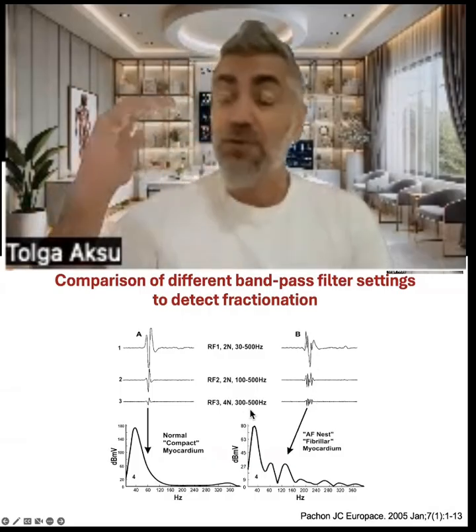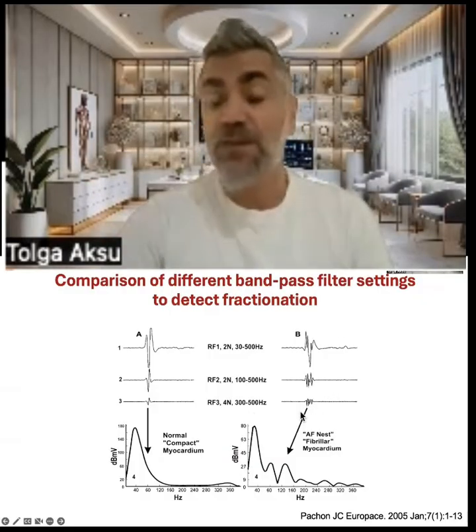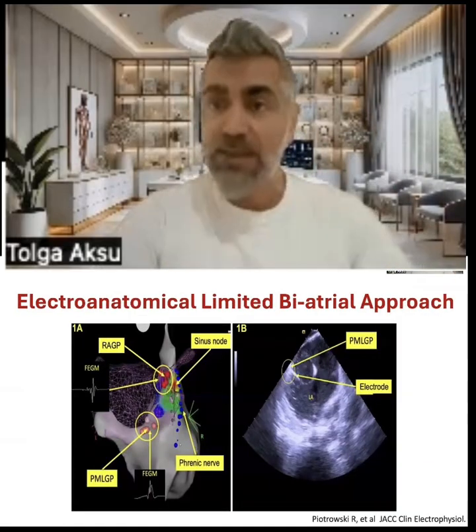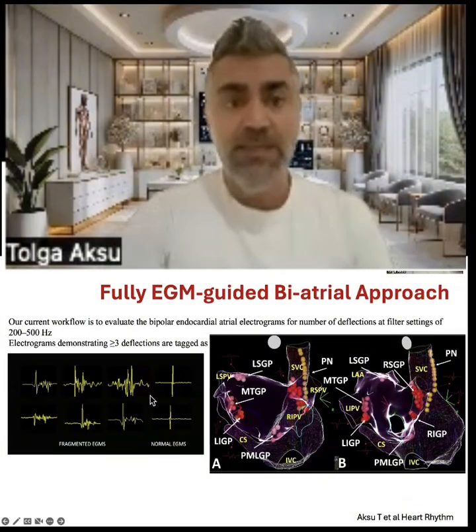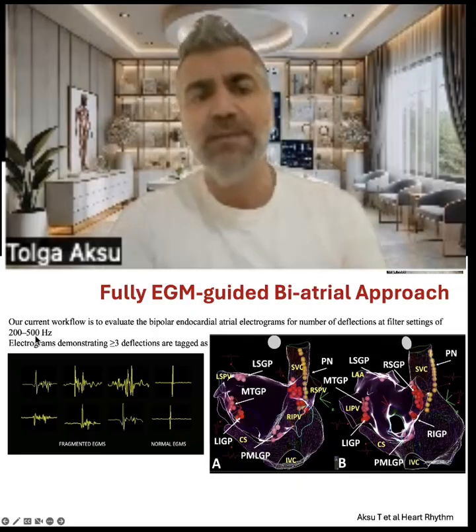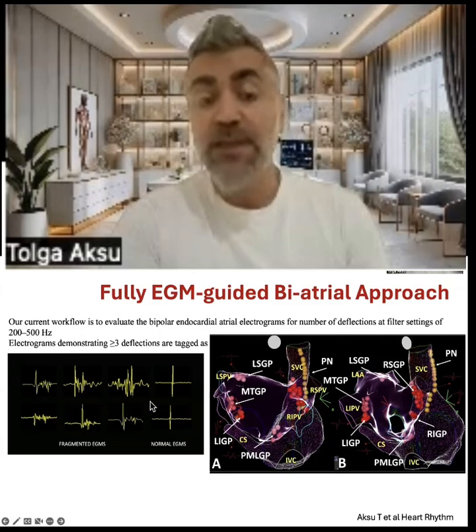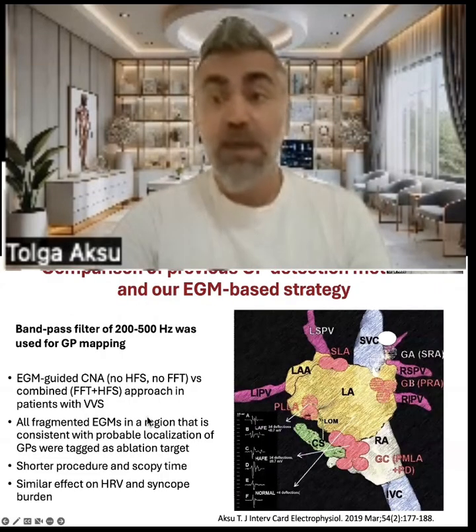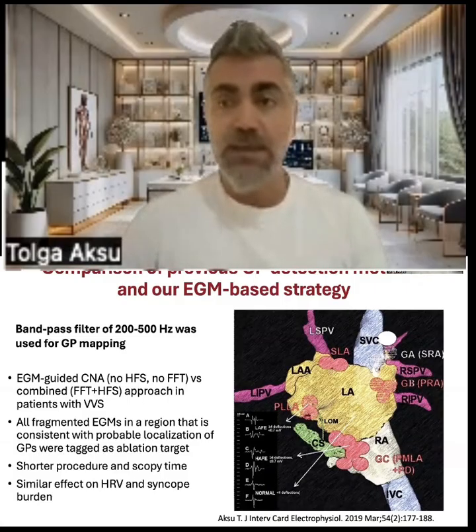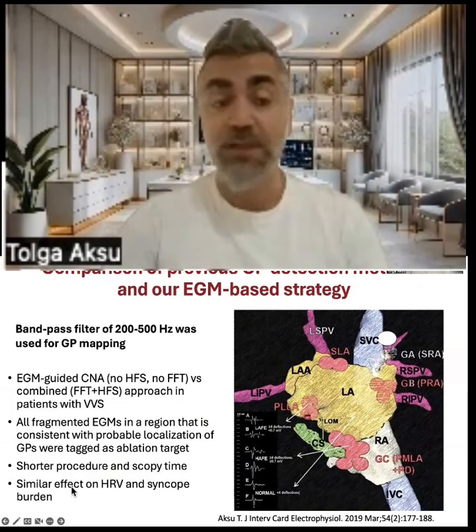But if you increase your high pass filter to 200 or 300 Hz, it will be easier to find such a fragmentation on electrogram. So different groups used a combination of electrogram analysis and anatomical landmarks. And as you see in here, by changing the bandpass filter to 200 and 500 Hz as suggested by Pachon, we are trying to find such a fragmented electrogram in possible GP area. And we compared this technique with a combination of high frequency stimulation plus spectral analysis, and we found shorter procedure and scopy time with a similar effect on heart rate variability and syncope burden.